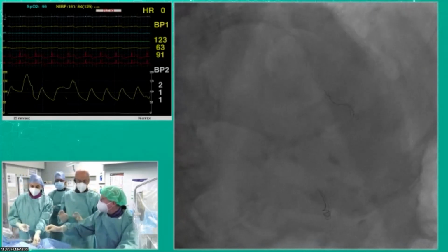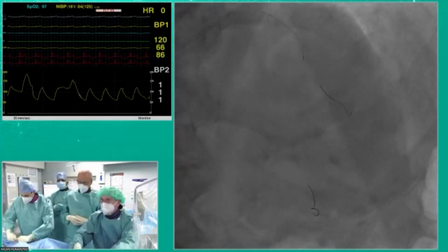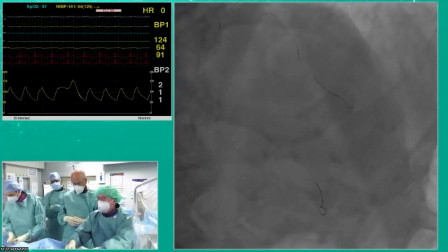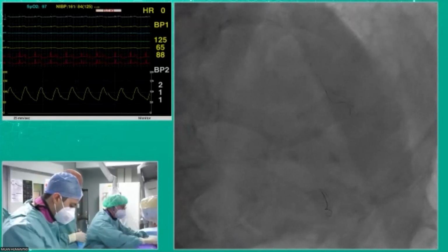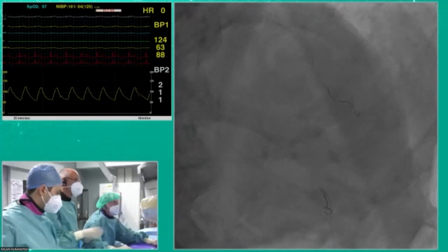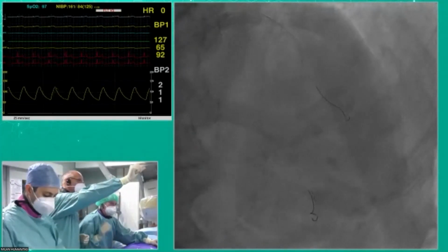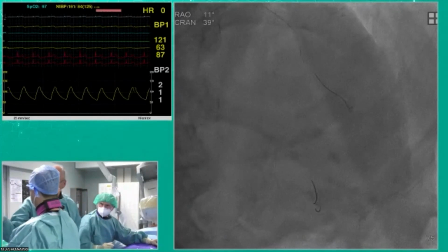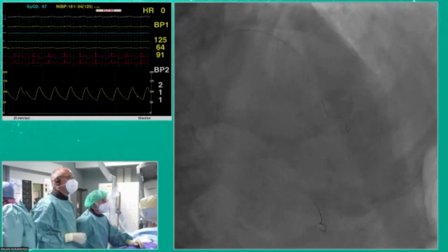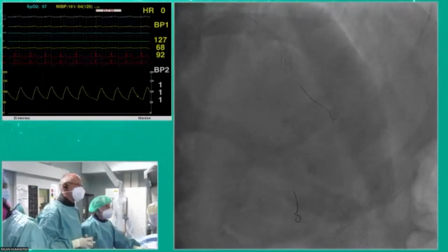Of course. Maybe if you put a stent, maybe 30. 3.0. Excuse me, 3.0. 3.0, because if you want to use 3.5, low pressure, the vessel is big. The vessel is big, but the cross, so let's go 3.0. Yeah, the area is 2.8. 3.0, yes. The diameter of the area that we achieved is 2.8, 2.6. Okay.